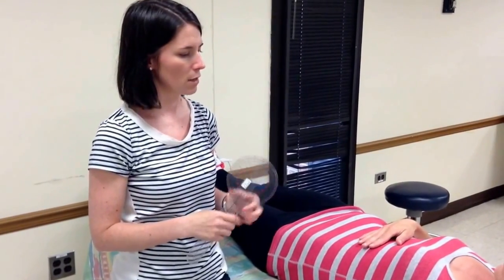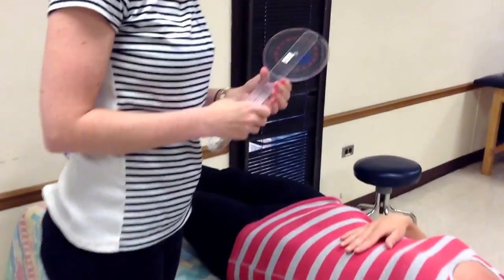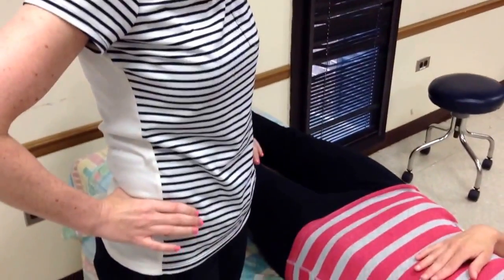For this, the patient is going to be supine on the bed, and I'm going to need to stand on a footstool right next to the patient in order to take this measurement. In order to line up my goniometer, I'm going to need to palpate the patient's ASISs.